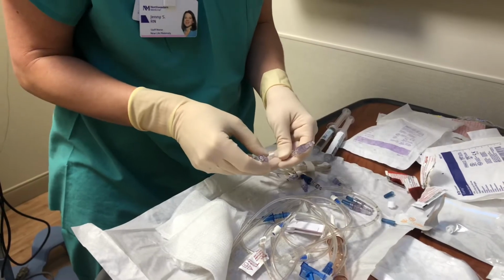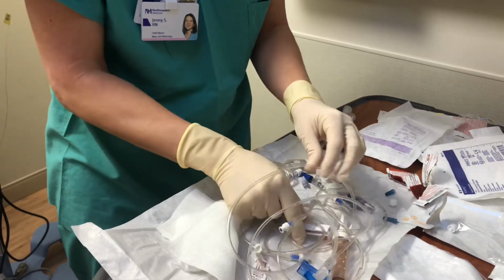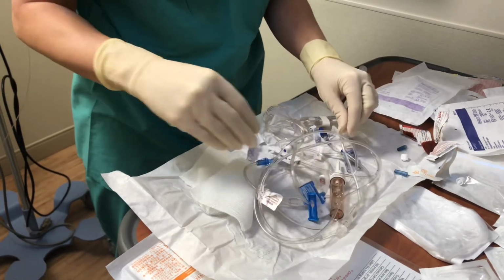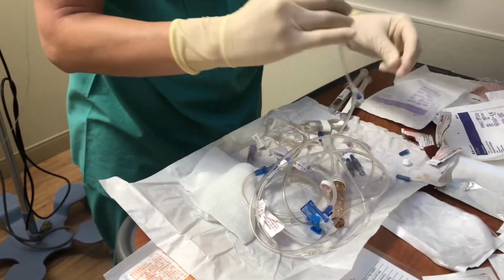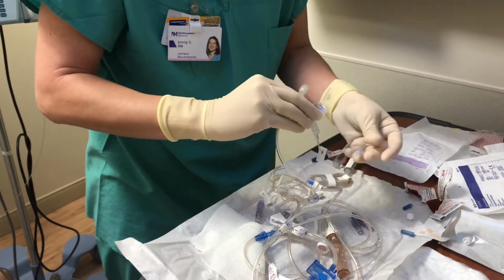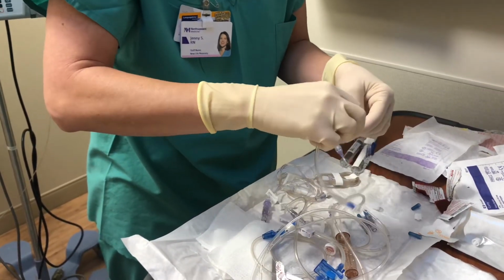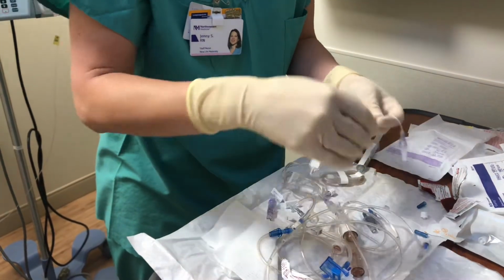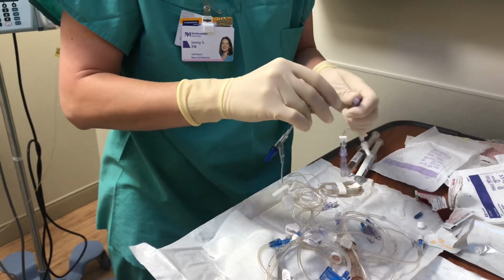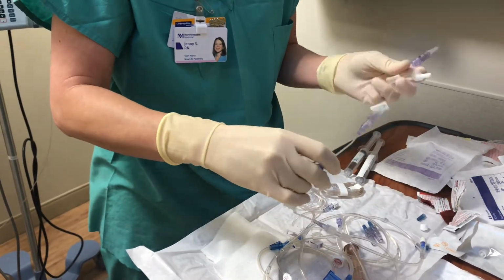And then next I'm going to do my TPN. So I'm going to close my roller clamp. And then I'm going to find the end of my tubing, and I'm going to attach that TPN filter. Remember, that's the 0.2 micron with the blue clave. So I'm going to attach my TPN IV fluid filter. And then now this is going to attach on one of my bifuse claves. And again, it doesn't matter which side you use. Okay, so we have that all together.